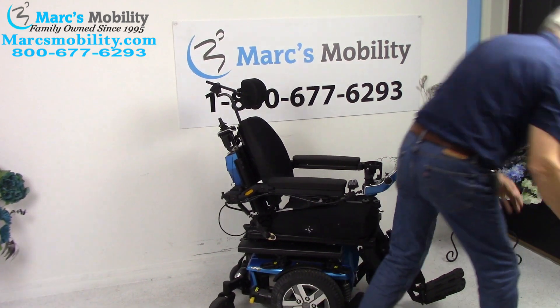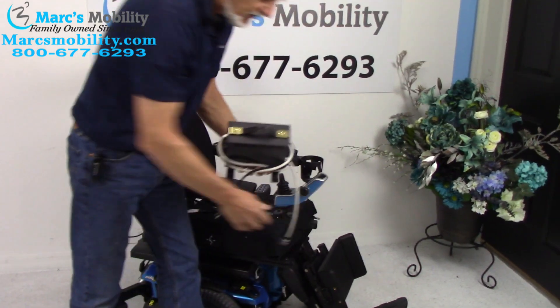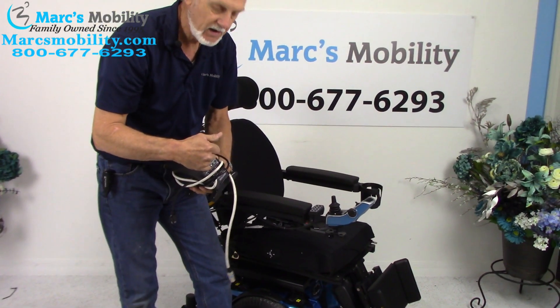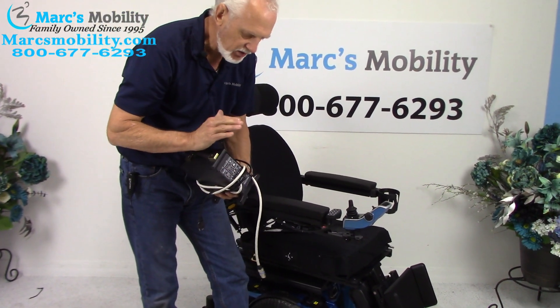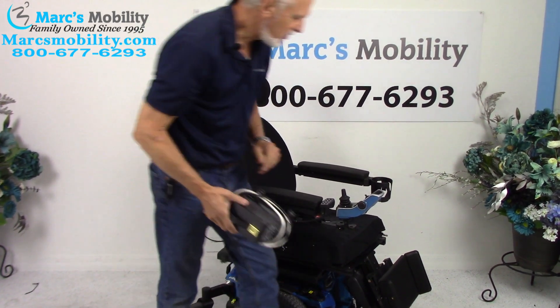When you charge this chair, you'll take your Quantum charger and plug it right below the joystick. As soon as the light goes from orange to green, the charger will turn off. These are smart chargers — they know when to stop charging.